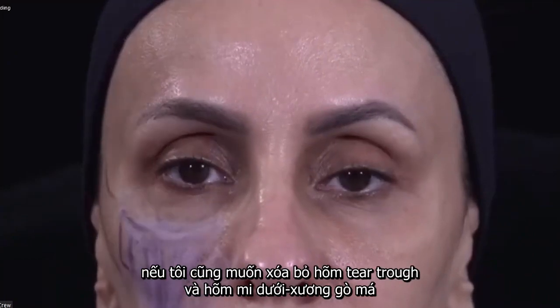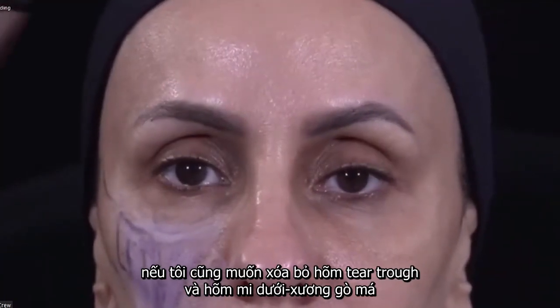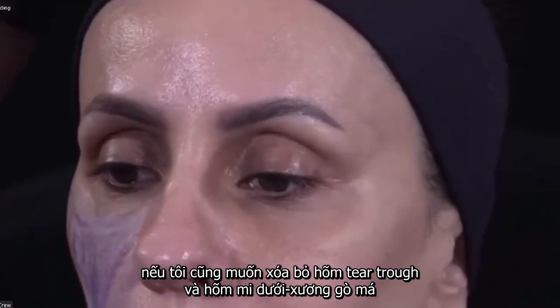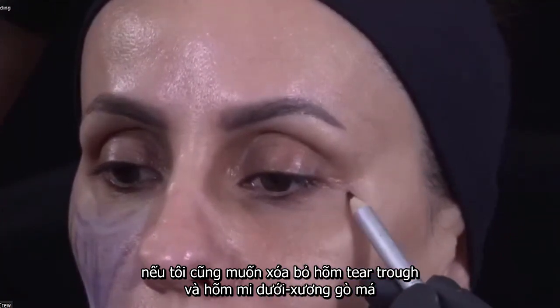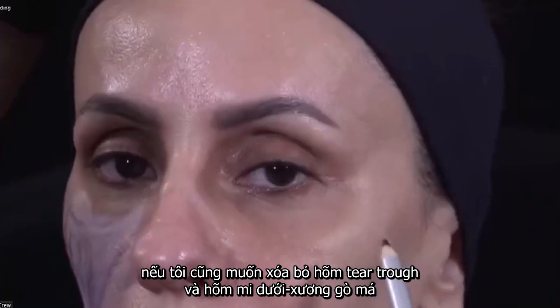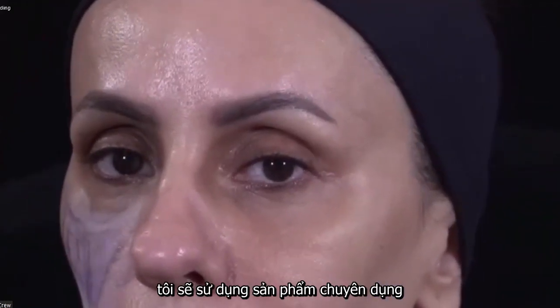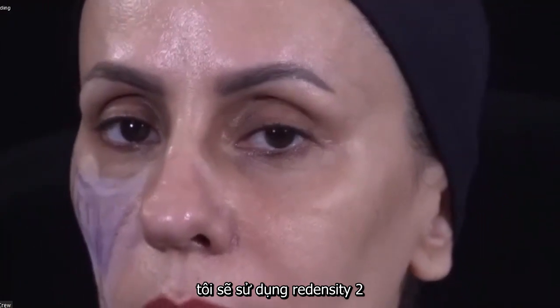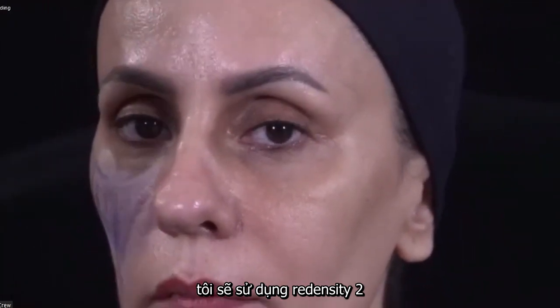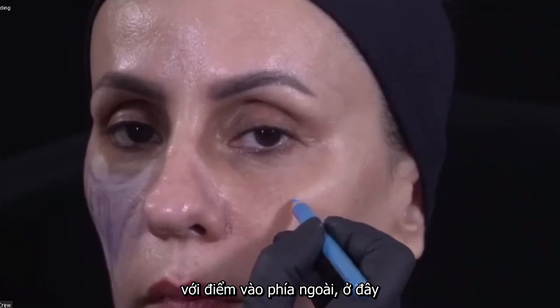So today, if I also want to remove the shadow of her T-trough and her lid-cheek junction, I will be using the dedicated product for that. I will be using Teoxane Redensity 2, with the lateral entry point here.